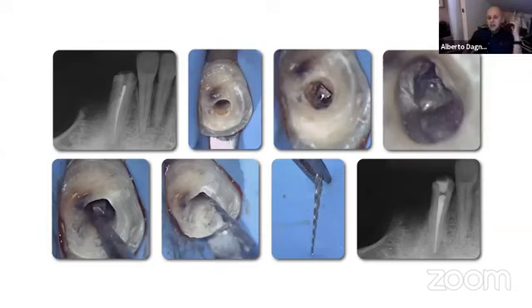This is a case I treated many years ago, in which you can find an entire nickel titanium file broken inside a straight canal. Probably the colleague who treated this tooth didn't do a correct pre-enlargement of the canal, didn't evaluate the hardness of the dentin, even if the canal is completely straight, and broke this old ProTaper Universal file, probably due to the taper lock inside the canal.